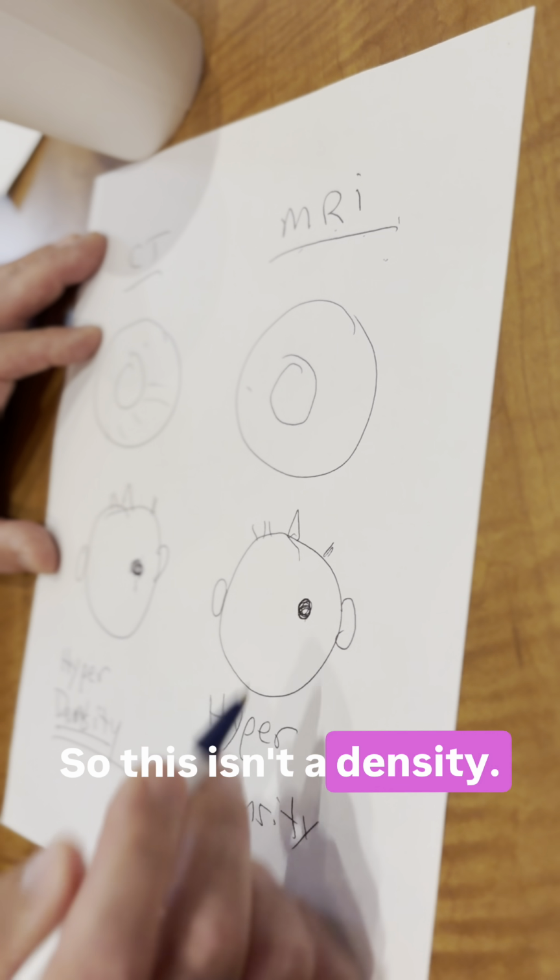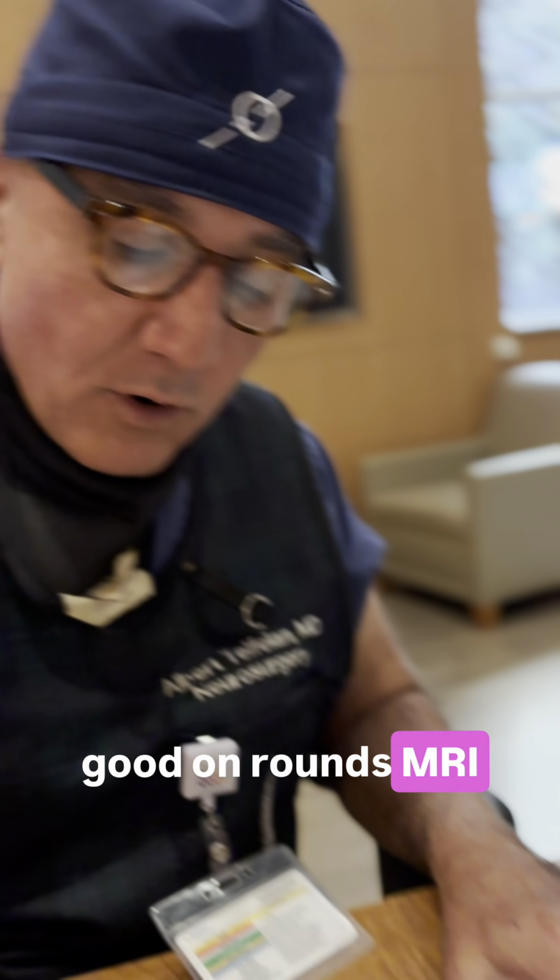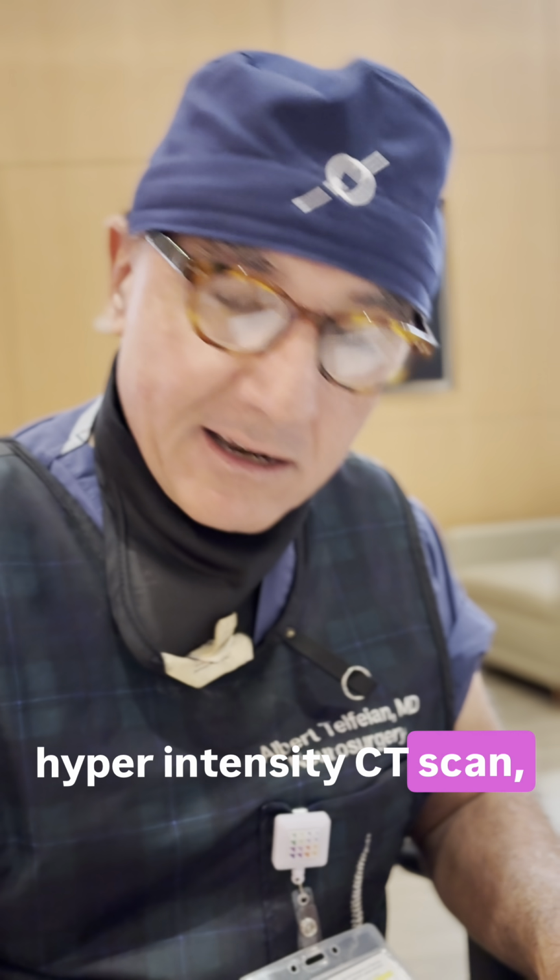So this isn't a density, it's a hyperintensity. So if you want to look good on rounds: MRI hyperintensity, CT scan hyperdensity.